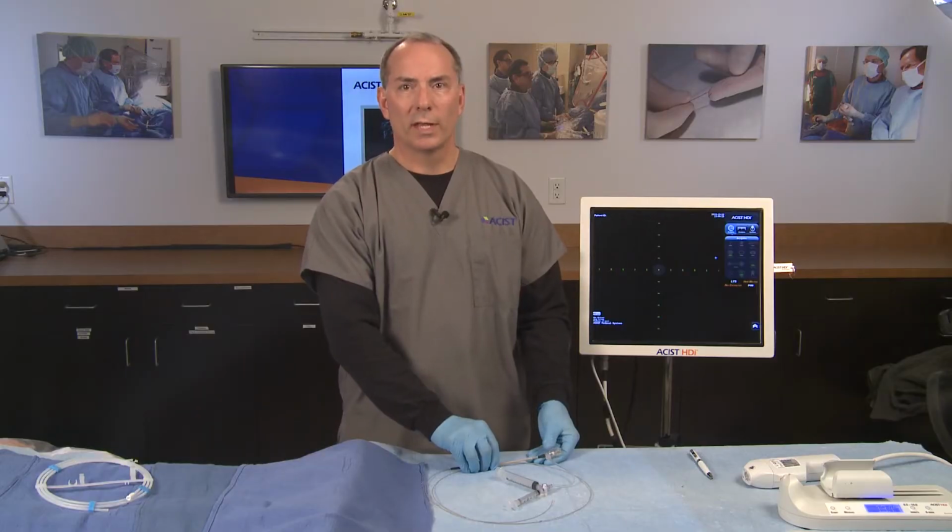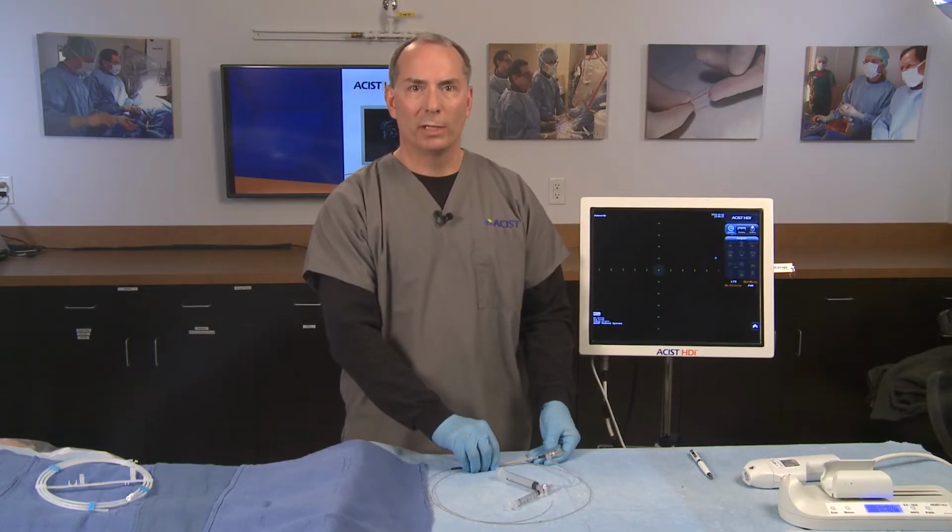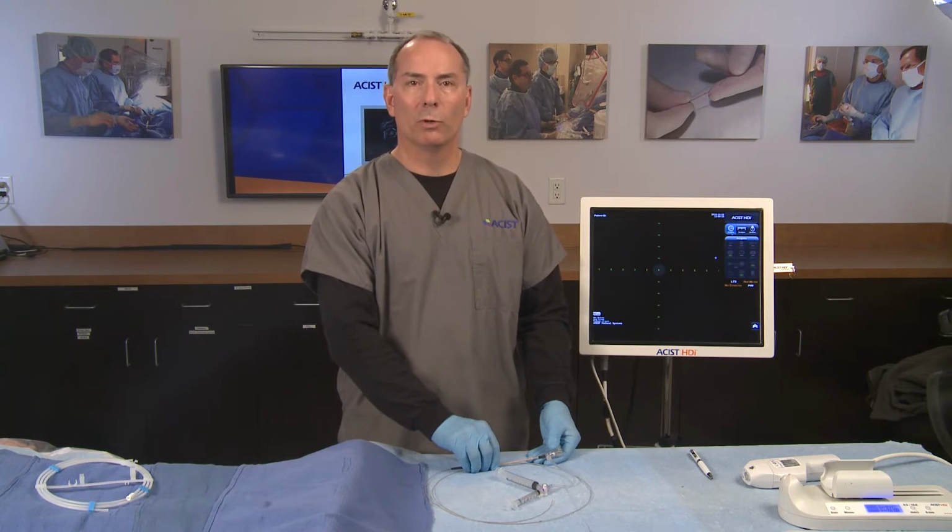The longitudinal translation can be performed manually by the physician or under motorized control from the LTS. Motorized longitudinal translation enables the acquisition of calibrated 3-dimensional volume data that allows the HDI system to accurately measure distances along the length of the artery under investigation.